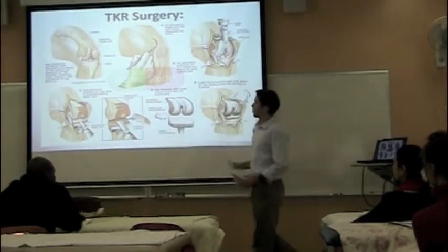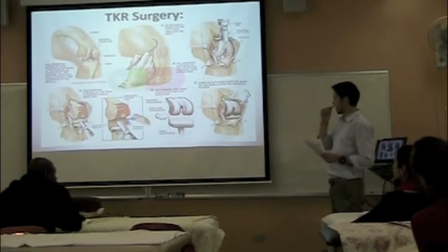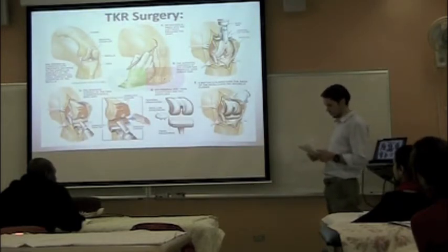And those will then guide the surgeons and the electric saw to cut the bone to perfectly fit the prosthesis that's going on it. That's then cleaned up, and they then use a medical cement, which they'll place on the clean bone and the prosthesis and then stick it in place. Once it's stuck in place, they'll go through the range of motion with the patient.